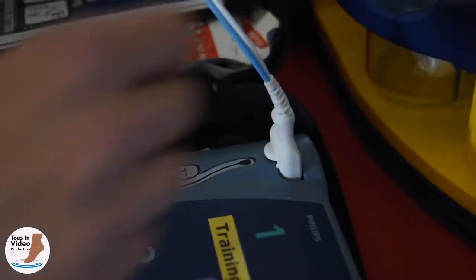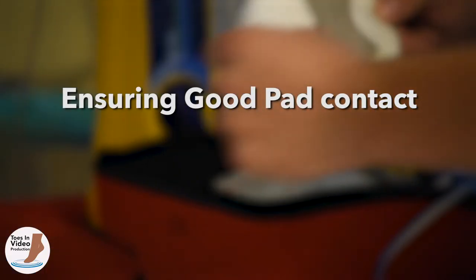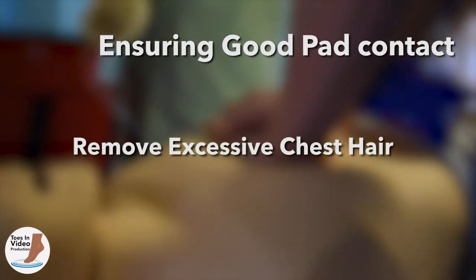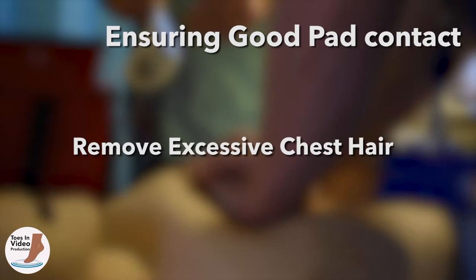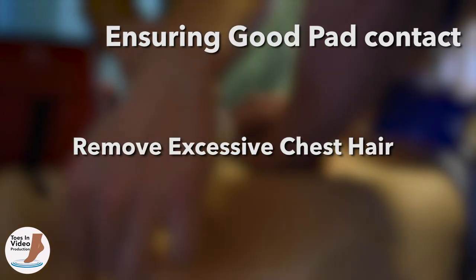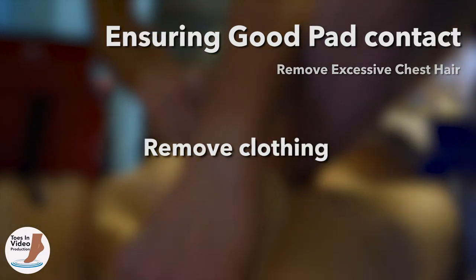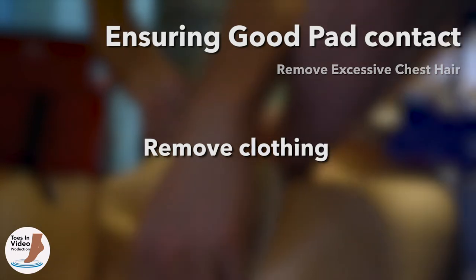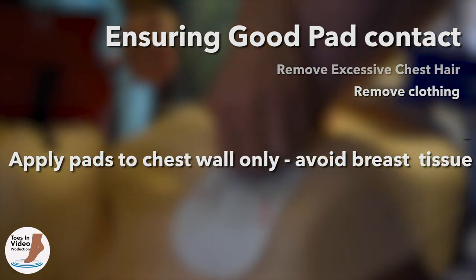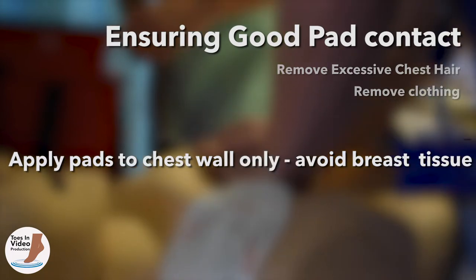Attach the pads to the machine where the flashing light indicates and obey the instructions. In patients who have a lot of chest hair, enough hair must be removed to allow good pad contact — a razor is provided for this purpose, or a second set of pads can be used to remove some of the hair. Clothing including a bra must be removed or cut off to allow rapid access to the chest — tough cut scissors are provided for this purpose. Pads should not cover the nipple in an adult patient; ensure the pad is applied to the chest wall and not to any breast tissue, to reduce impedance and resistance and to optimise current delivery to the myocardium.